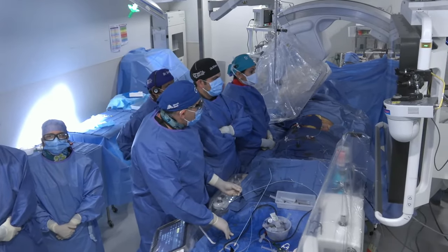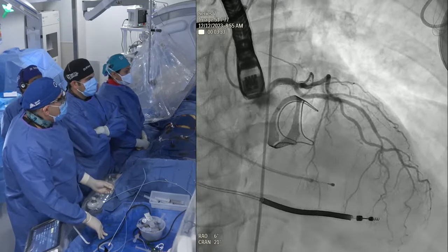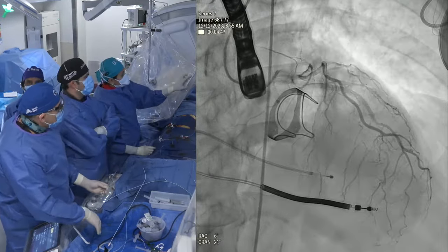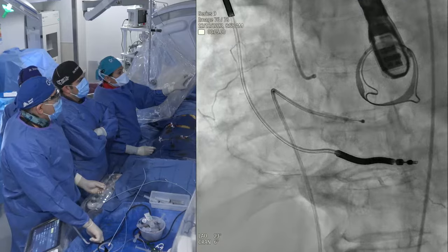This patient had a coronary angiogram done because of issues in the past, which is okay. Now I can direct it to Dr. Keeney. Anu, tell us what's going on now. So if you can show the angiogram, you can see the coronary angios, non-obstructive. So we've completed the transseptal.